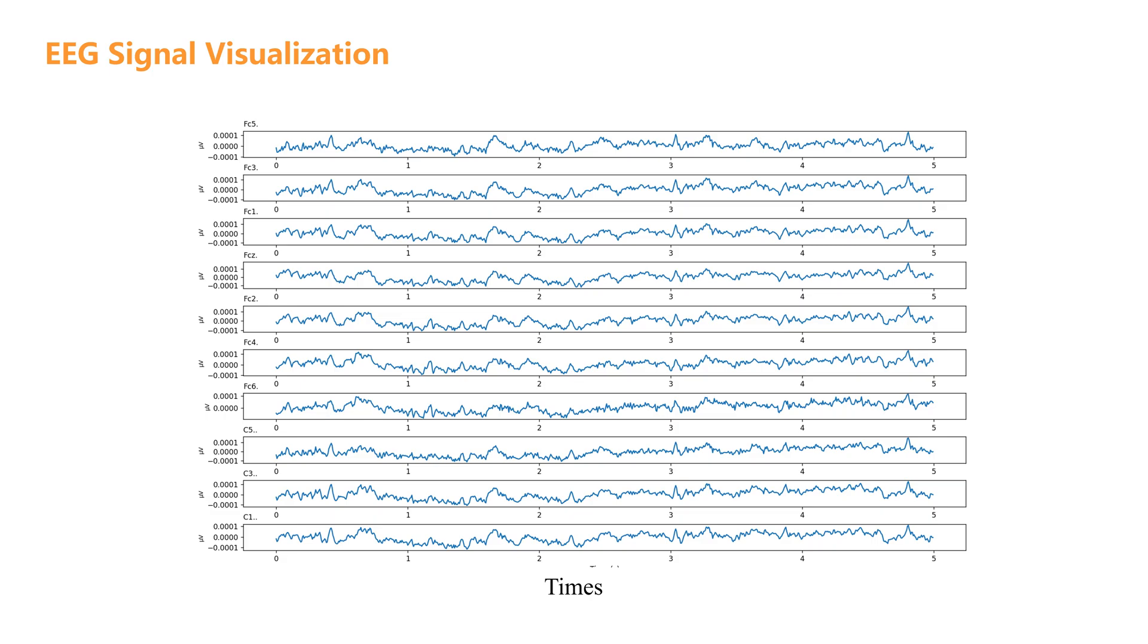Let's take a moment to understand what we're looking at. On each plot, the horizontal axis shows time measured in seconds. Since we extracted just the first 5 seconds of data, each plot will show activity from 0 to 5 seconds. The vertical axis displays the signal amplitude measured in microvolts. This tells us how strong the electrical activity is at each moment. At the top of each subplot, you'll see a title showing the name of the EEG channel being displayed. These names typically indicate where the electrode was placed on the scalp.